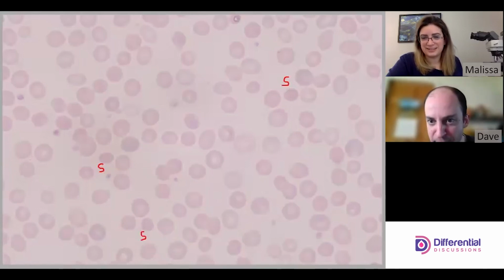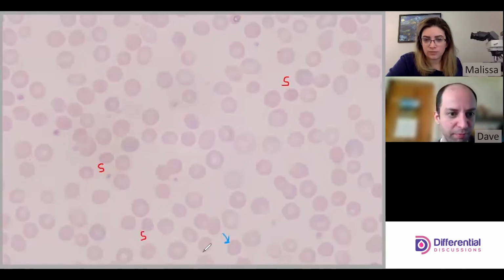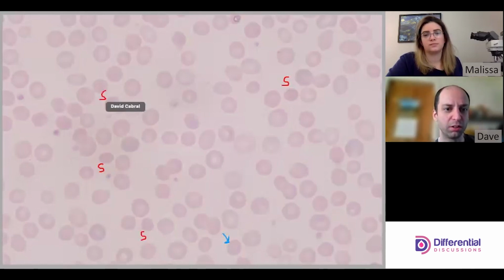Mm-hmm. Maybe this one right here is a good one too. Yes, agreed. And then maybe put it below, just touching the one above that S right there, maybe. So I think we're getting to a pretty stable number for a 1+.